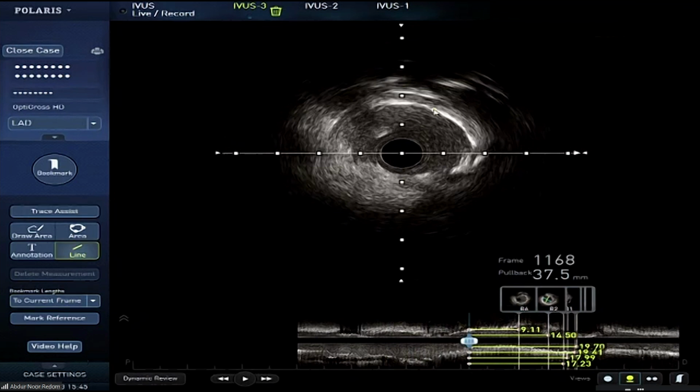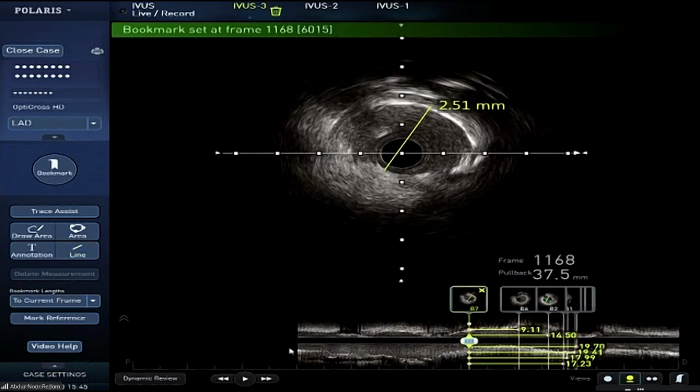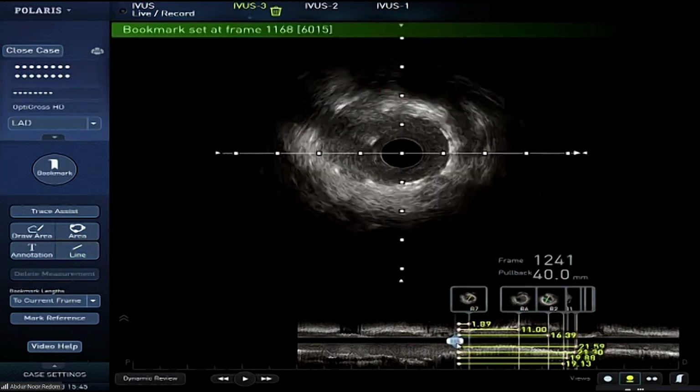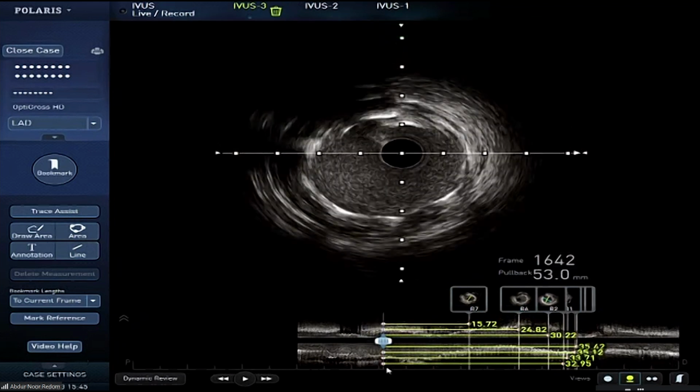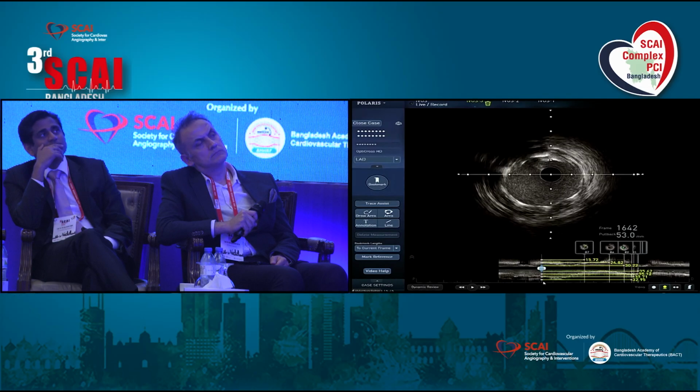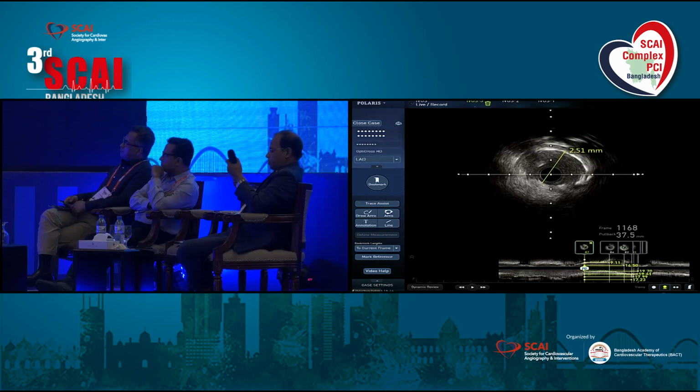Can I withdraw the side branch wire? Did we take a picture? So you are allowing 900 micrometer malapposition? Yes, that's one of the research, as I said, that malapposition is anything more than 200 you have to pay attention to, and the run-through wire was a little bit stuck there, but we were able to get it out.